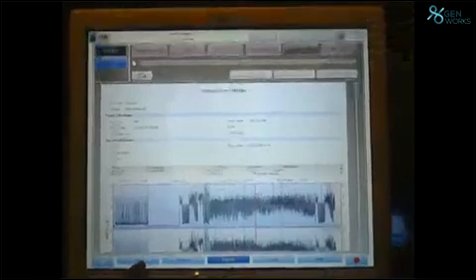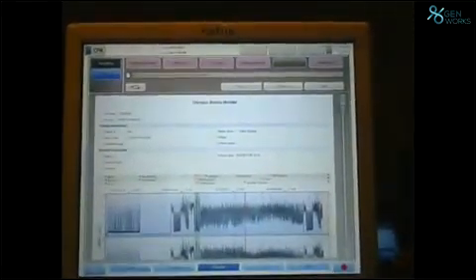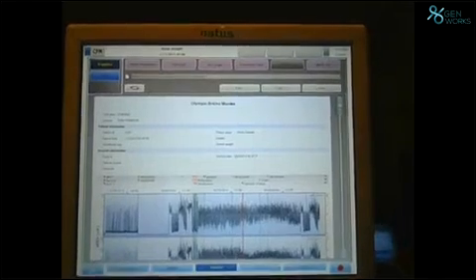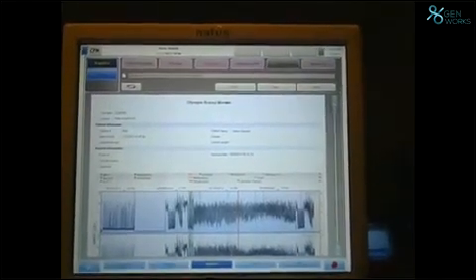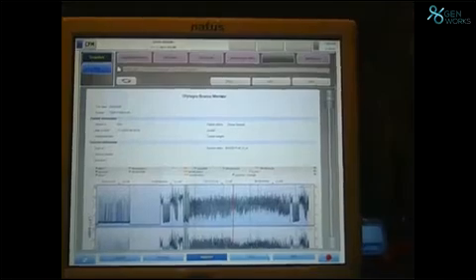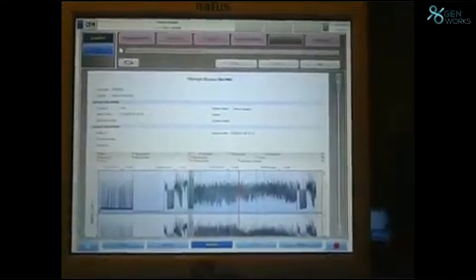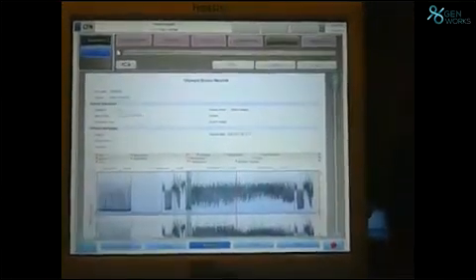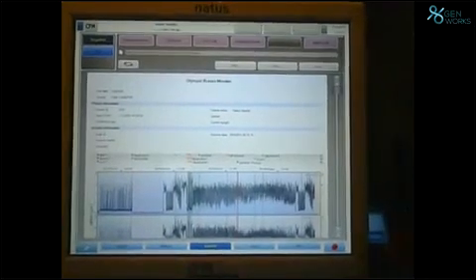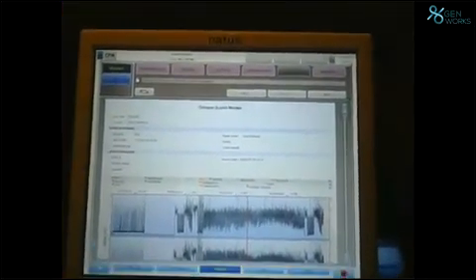Then you are going to put in the pen drive. Okay, this is the pen drive. You are going to put the pen drive in the backside. Show where you are putting it. This is the pen drive, so she is going to put it in the backside. Immediately you can take the printout from your desktop or whatever printer you have, and you can go. So one snapshot you have given.